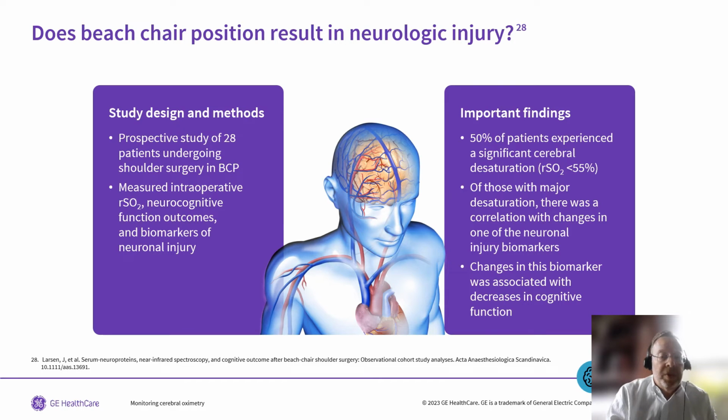What about more subtle signs of neurologic injury? Does cerebral desaturation during beach chair position result in neurologic injury that can be detected with more subtle neurologic testing? Well, in this study, which was a prospective study of 28 patients undergoing surgery in the beach chair position, they measured intraoperative regional saturation, neurocognitive function outcomes, and again, biomarkers of neuronal injury.